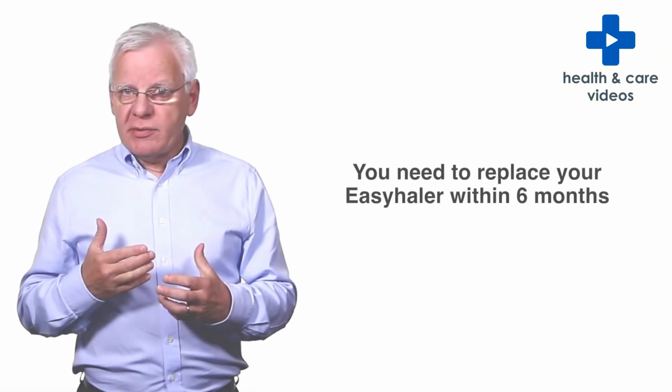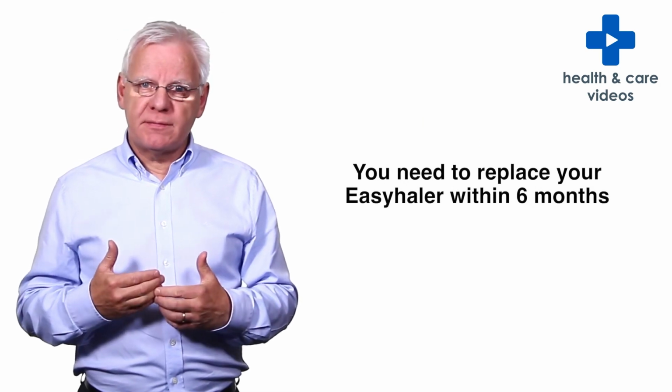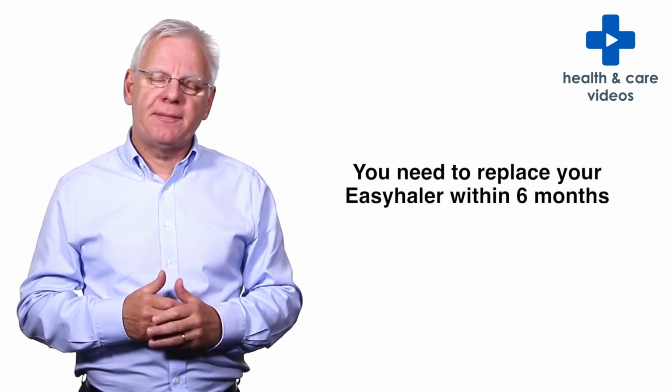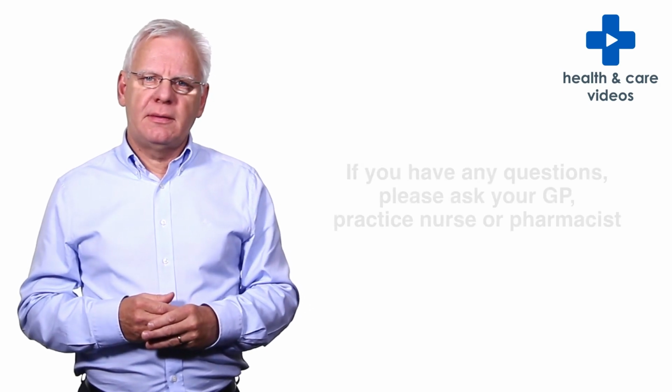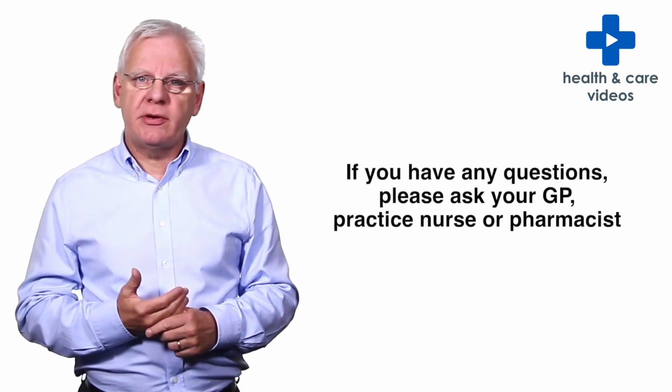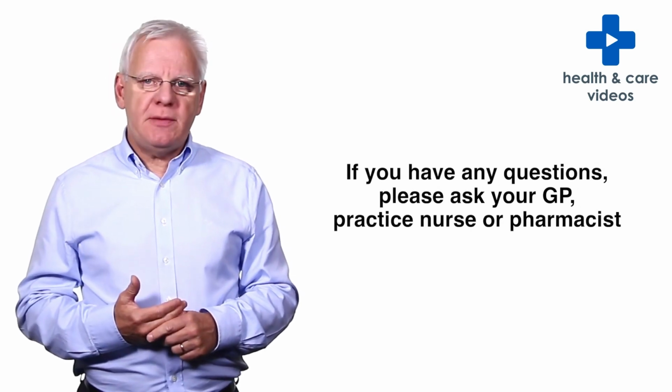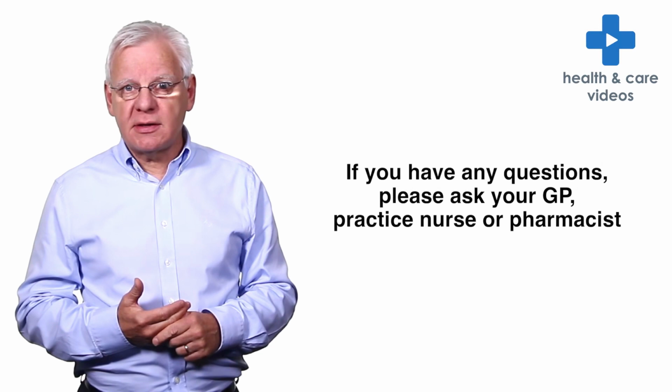You'll need to replace your Easyhaler within 6 months, starting from the time that you removed the inhaler from its laminate pouch. If you're unsure about how to use your Easyhaler inhaler or have any other questions, speak to your GP, practice nurse or pharmacist for assistance.